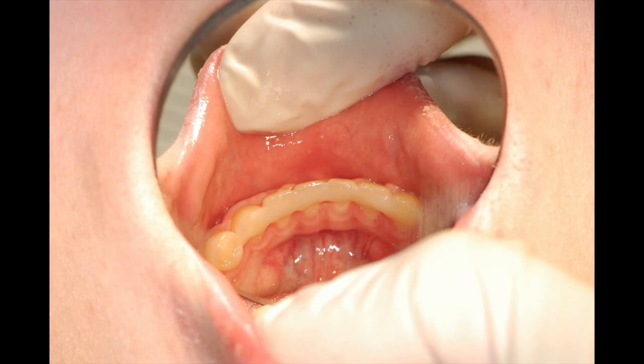Thank you for taking the time to watch this short clinical tip on how to splint periodontal teeth and to fabricate an orthodontic retainer.